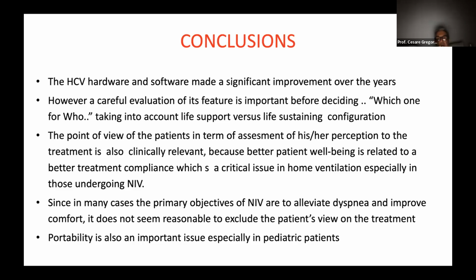The point of view of the patient, in terms of assessment of his or her perception of the treatment, is also clinically relevant because better patient well-being is related to better treatment compliance, which is a critical issue in home ventilation, especially in those undergoing non-invasive ventilation. Since in many cases the primary objectives of non-invasive ventilation are to alleviate dyspnea and improve comfort, it does not seem reasonable to exclude the patient's view on the treatment.